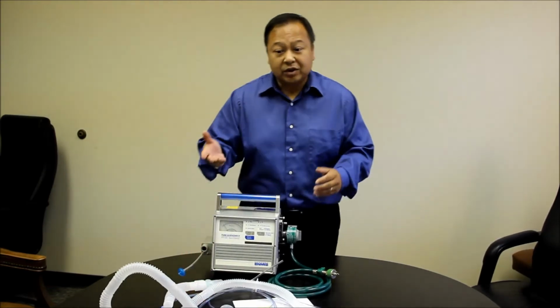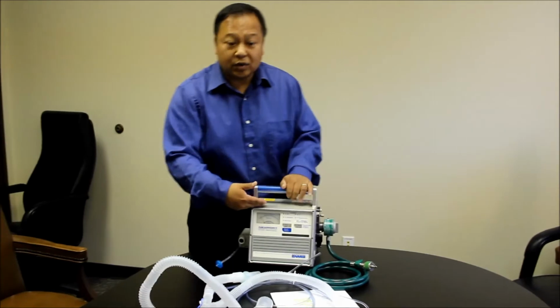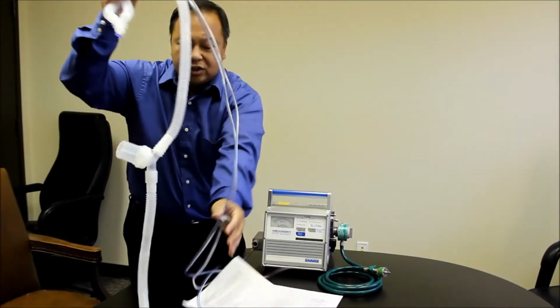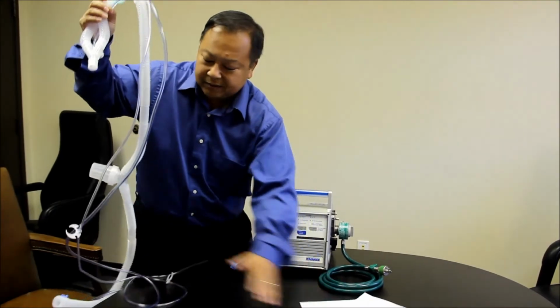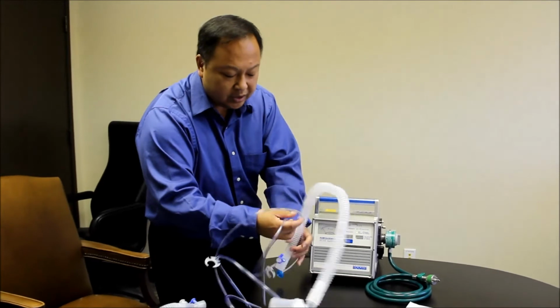Okay, so the first thing I'm going to do is just kind of put the ventilator together and go through the different modes that we can put the patient on. All right, so most of the tubing comes preset. They come out like this. They're very standard. They're very universal now. But you need to know where things go.